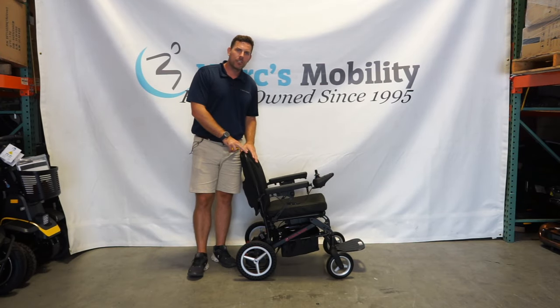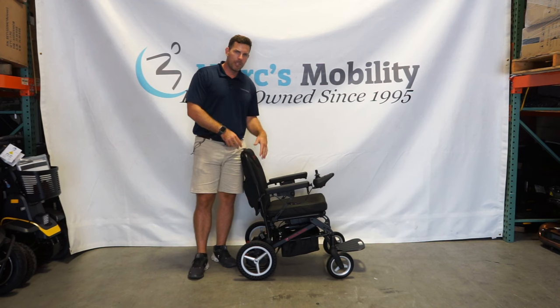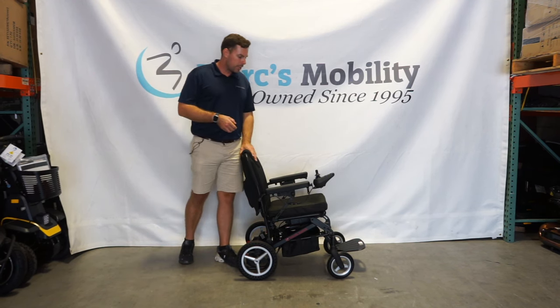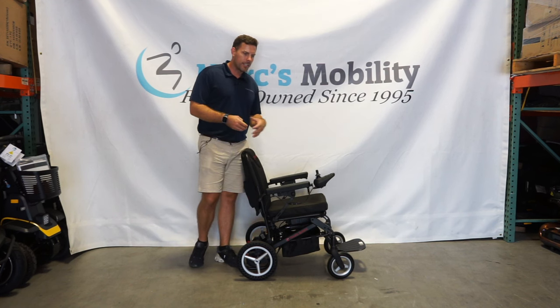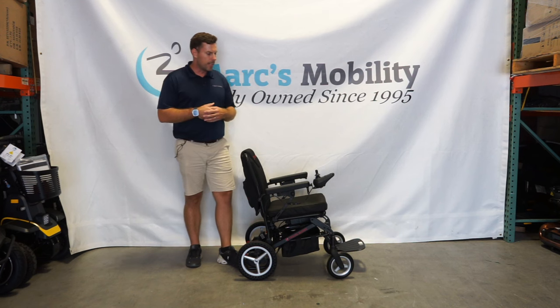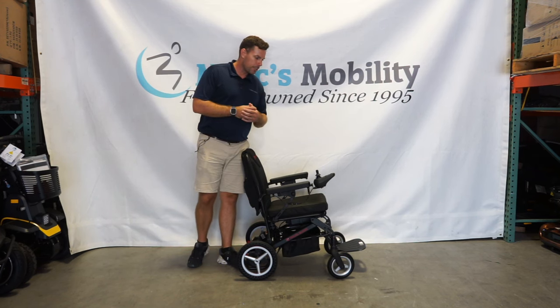In this video we're going to show you the Dash Ultralight. This is a product by Travel Buggy, a Canadian based company, but they actually carry a few nice folding models. What makes this unit really nice is this is a folding compact unit that is airline approved and cruise ship approved, so basically all your types of transportation you can take this on.